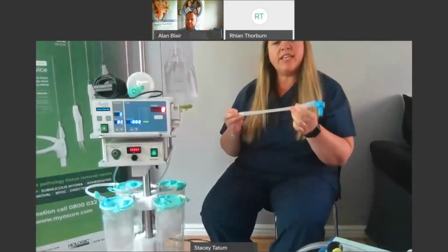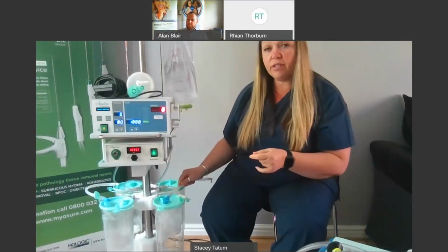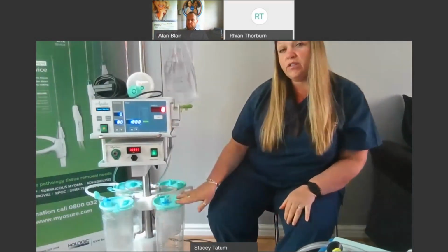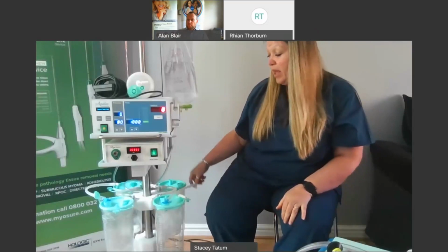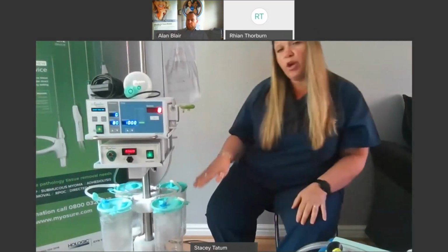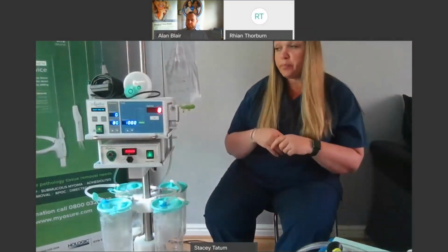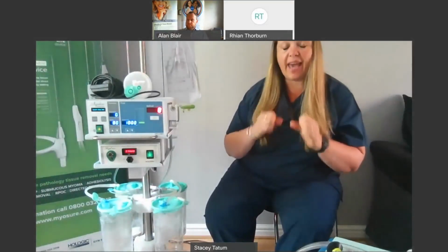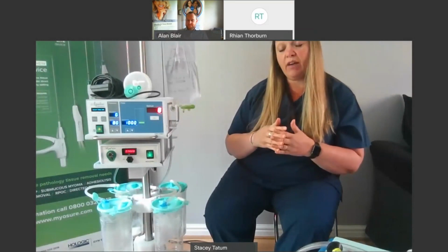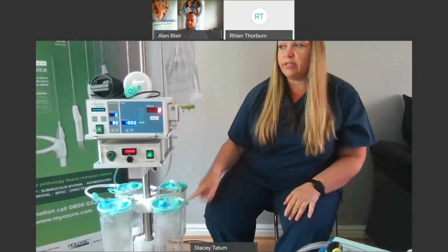You will also have tandem tubing. The blue, the biggest end, goes into the front canister. Again, seal that down nice and tight. So once this one's filled, if it needs to have any more fluid, it will pump into the back one. So then I would go around and check each canister, that all the lollipops were lined up and everything was sealed down tight. I cannot stress to you how important that is, because when you have troubleshooting during the procedure, 99% of the time, it's going to be one of those canisters.